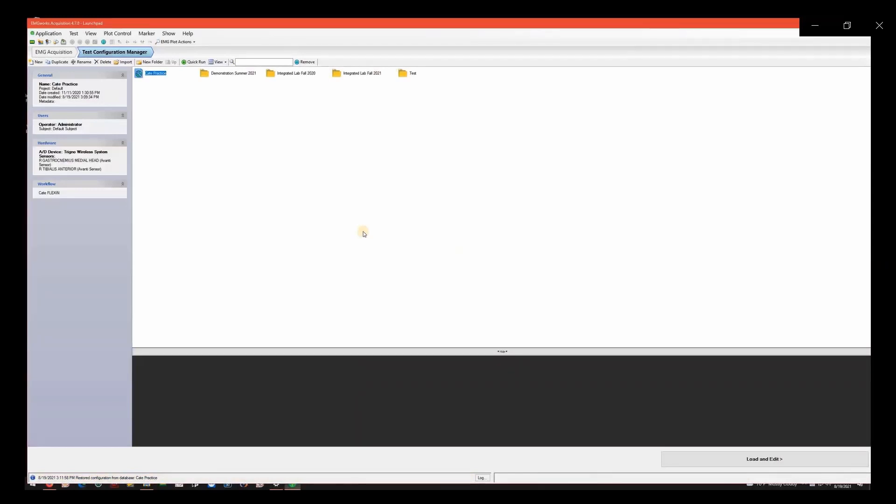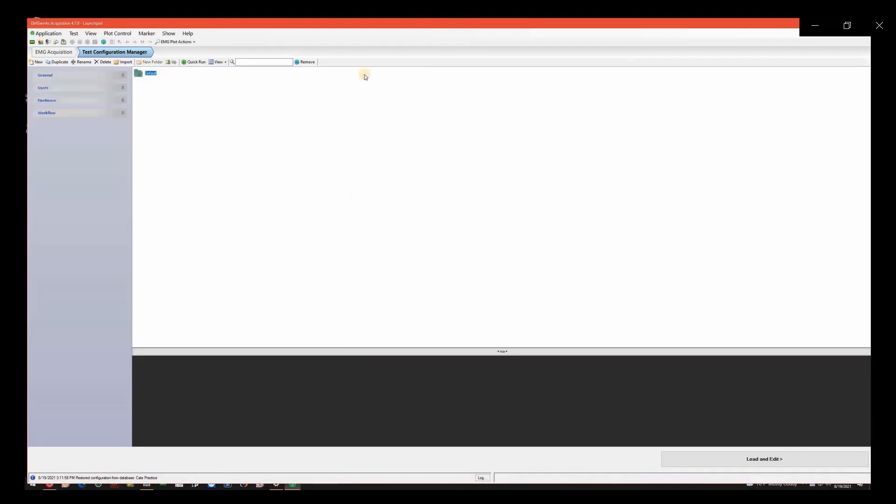You will create a test configuration file that contains the details of your project. First, locate the folder of your class and double-click to enter it. Click New to create a new project file.